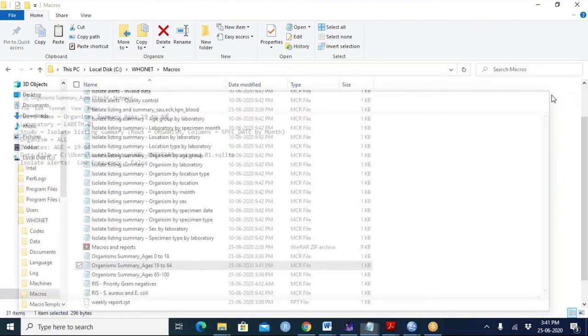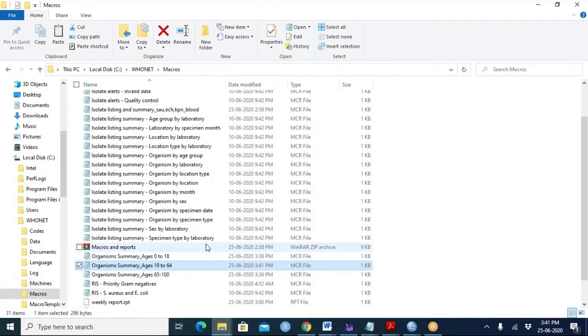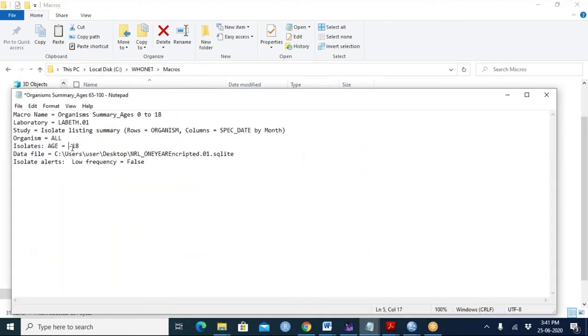Okay, and then we do the same thing for the last one, the H65. I would put maybe 120. I mean, you might have some people 101, 102. Just put something that you think is a reasonable upper limit. Maybe, can we do this one greater than something? I think, if I remember correctly, you can just get rid of the one. I think if you put 65 hyphen, it will work. Get rid of the one there. I think this will work.